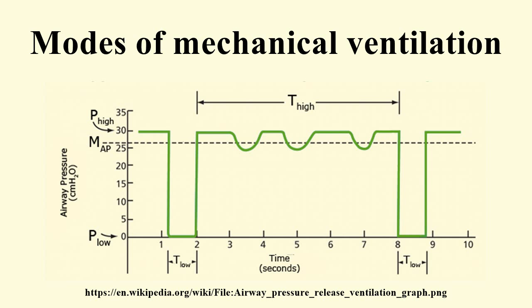Step 2. Identify the breath sequence. Determine whether trigger and cycle events are patient or machine determined. Then, use this information to determine the breath sequence. Step 3. Identify the targeting schemes for the primary breaths and secondary breaths.